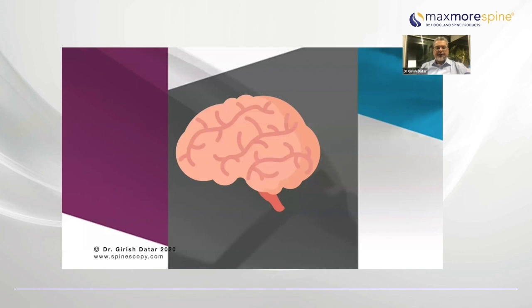you can do a unilateral decompression for these patients under local anesthesia with the patient completely awake and aware. If a patient is not fit to undergo any kind of interlaminar procedure because you require anesthesia for that, you may attempt it in stages also. But if the patient is by and large fit, you would want to do the procedure in a single stage, and interlaminar will be a choice.